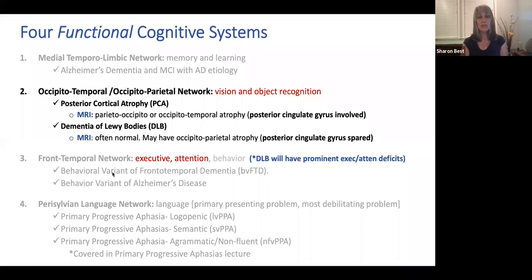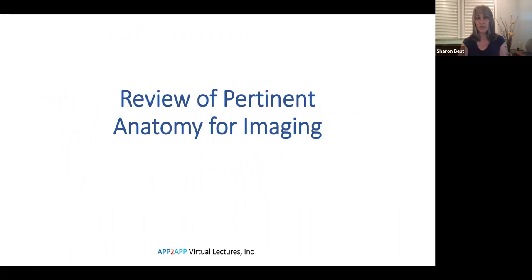We would expect that MRI, if she has posterior cortical atrophy, to show parietal-occipital or occipital-temporal atrophy in greater proportion to the rest of the cortex. We would also expect that perhaps the posterior cingulate gyrus is involved, which I'll explain momentarily. So let's review some pertinent anatomy for imaging first, before we look at her imaging.